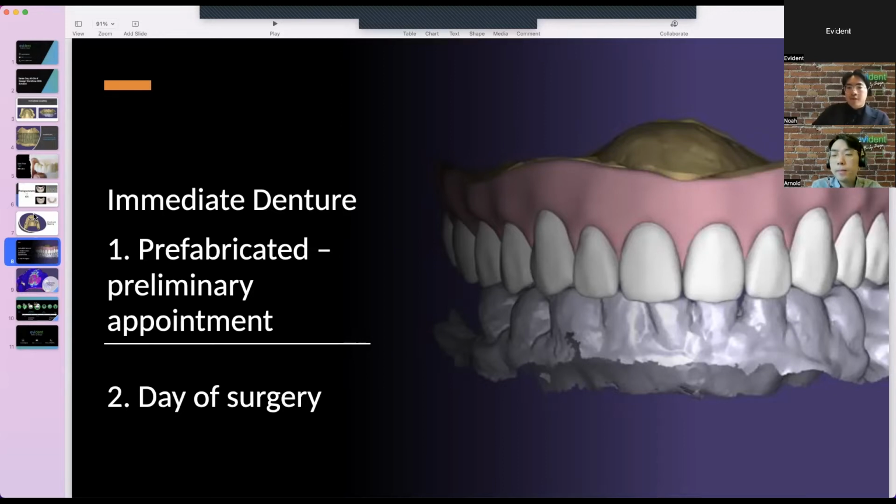Yeah, so just to reiterate some key points here, communication with your digital treatment planning expert is really important. All-on-X cases are very complex, and I know a lot of clinicians get pretty anxious going into it. So you want to make sure you're communicating any concerns. When you do want immediate turnaround time, please let your digital treatment planning expert know, so we can make sure everything is set up so things run smoothly on the day your patient gets there.